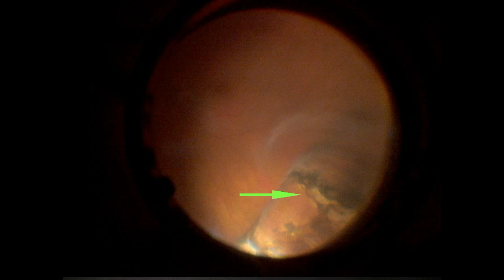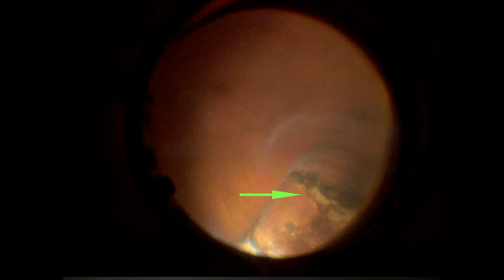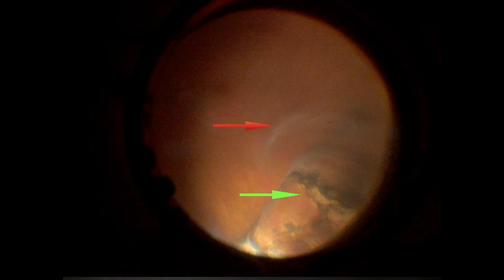This is an intraoperative view of retinal detachment. That's the view after placement of the buckle, and that's a satisfactory view. The area of interest is well on the buckle. Although there appears to be more fluid behind the buckle, this fluid is being pushed backward from the buckle — that's fine, and it will absorb. There's no need for drainage.